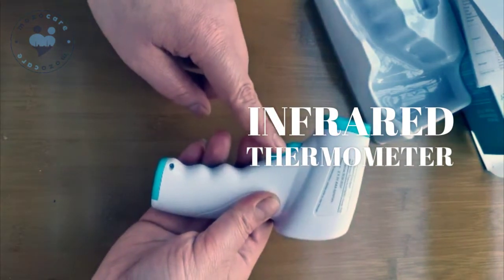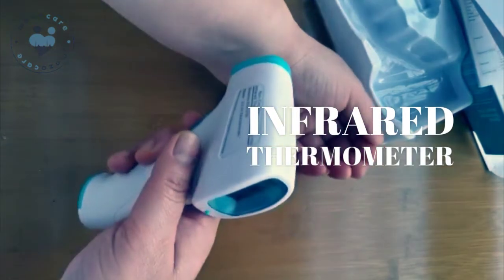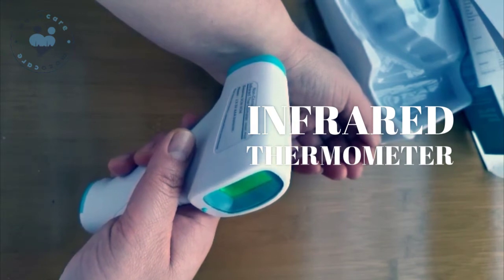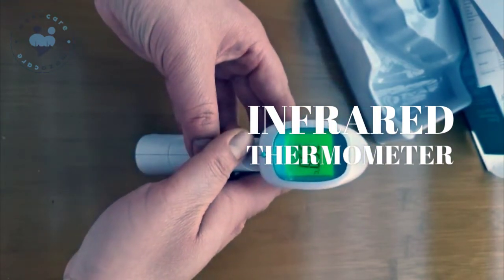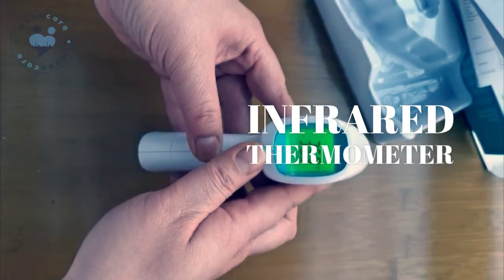Press this button again to do a test. Once you hear the beep sound, you can see the temperature. It shows degrees in Celsius. In case you want Fahrenheit degrees, you can press this button for a long time.